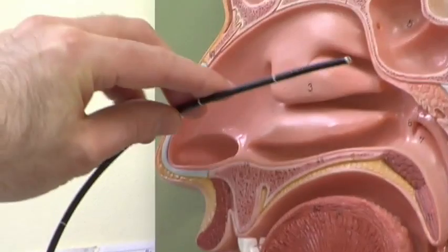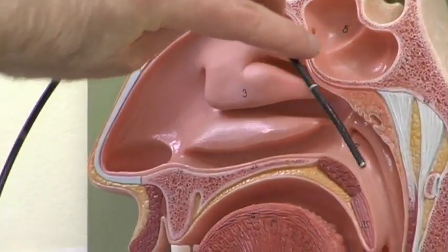What we're going to be doing in a minute - we're going to take a little tiny flexible scope with just a tip, and we're going to be looking with the scope via Daniel's nose, right along past his soft palate down to his vocal folds. We'll be looking and seeing what his larynx and the muscles around the larynx, the muscles in the pharynx, actually do, and how they contribute to the sound that Daniel makes.